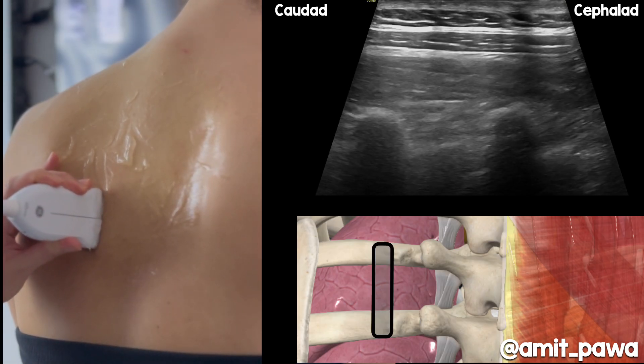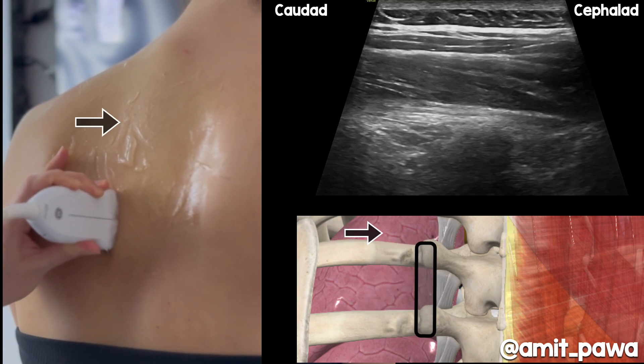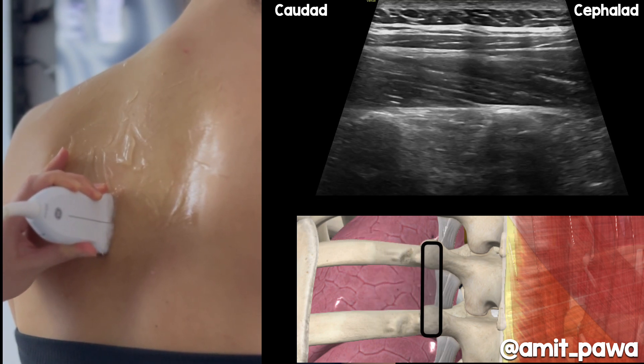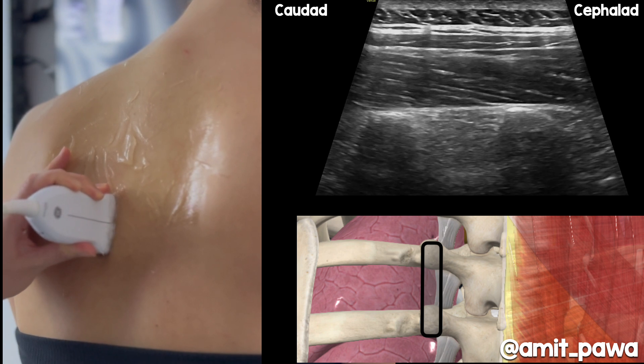Let's start with a high frequency linear probe lateral on the chest wall, and we slide our probe towards the midline. As we slide the probe towards the midline, we see the bony outline of the rib change to become a more rectangular or tombstone-like appearance of the transverse processes. As we go from lateral to medial, the erector spinae muscle bulk gets much larger and more visible, but you'll notice the pleura is not that clearly visible when you're truly paramedian sagittal.